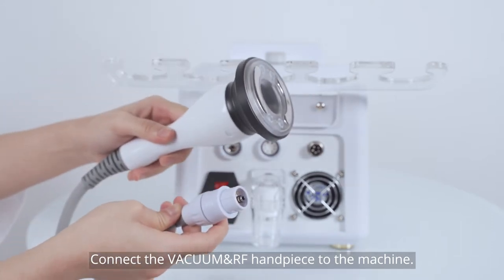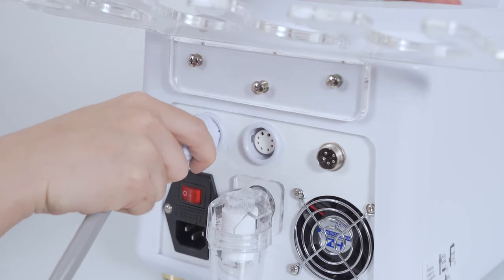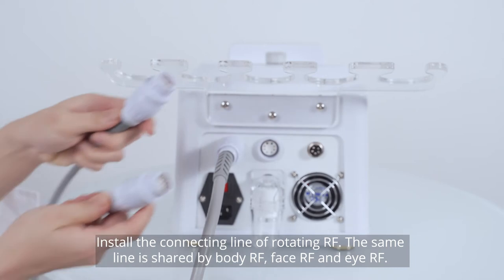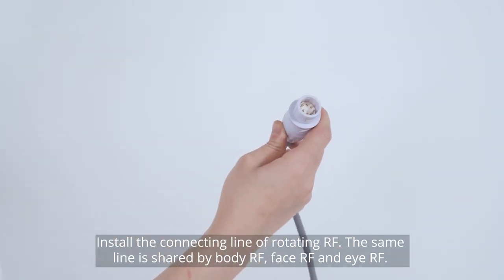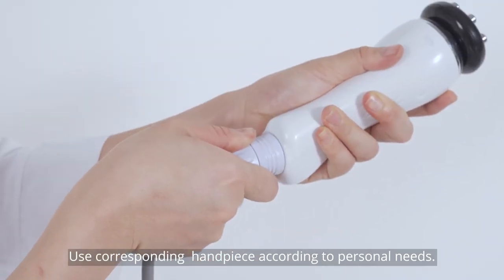Connect the vacuum and RF handpiece to the machine. Install the connecting line of a rotating RF — the same line is shared by body RF, face RF, and eye RF. Use the corresponding handpiece according to personal needs.